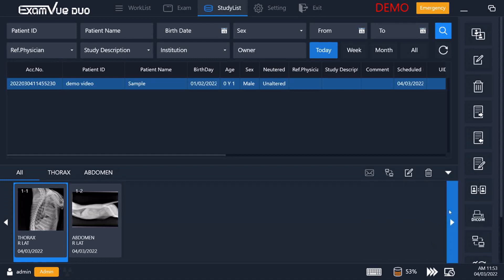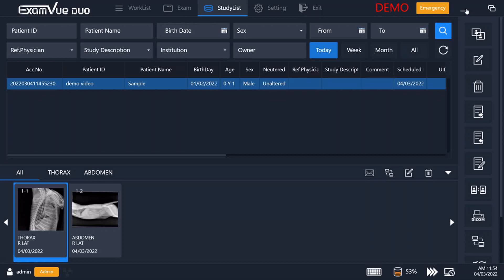When you're all done, you can simply exit or minimize the software using the exit button or the minimize button up top. Thank you for listening and joining us. There are obviously a lot more features in ExamVue Duo and we will be doing additional videos in the future to show you some of those in-depth functions. I hope you've seen how intuitive, easy to learn, and convenient ExamVue Duo is for taking, viewing, and sharing your X-rays. For more information, please go to our website at www.ExamVueDigitalXray.com or reach out to your local dealer to ask about ExamVue Duo. Thank you.